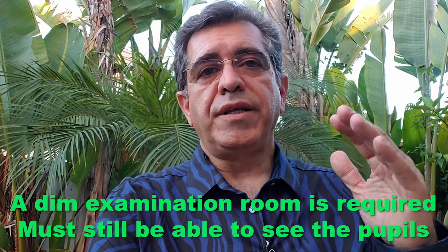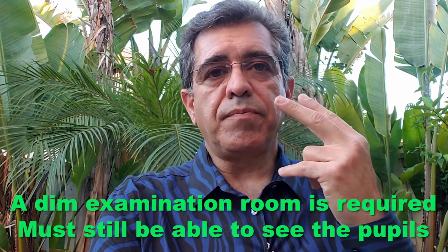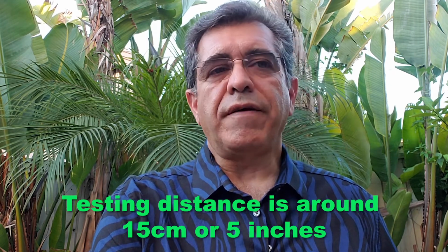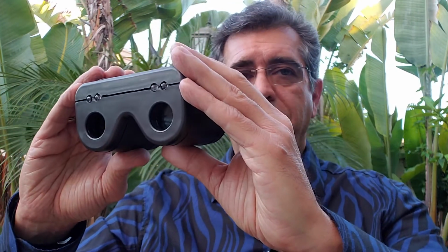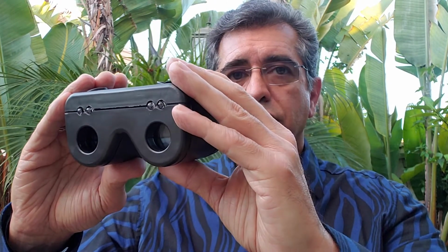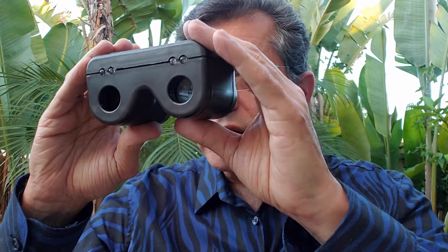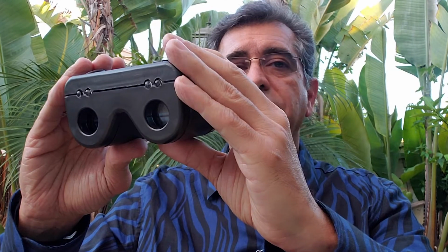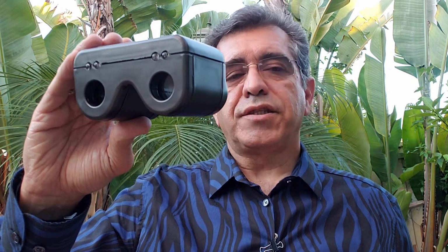To begin the test, the examination room should be dimmed to the level that you could still see the pupils of the patient. The distance of the device to the patient will be about 15 centimeters or 5 inches. Hold the instrument at that distance to the patient with both hands, and then get yourself closer to be able to look through the oculars like this. Make sure you're in focus by adjusting your distance to the patient. If you see double, it's just fine. Just continue.